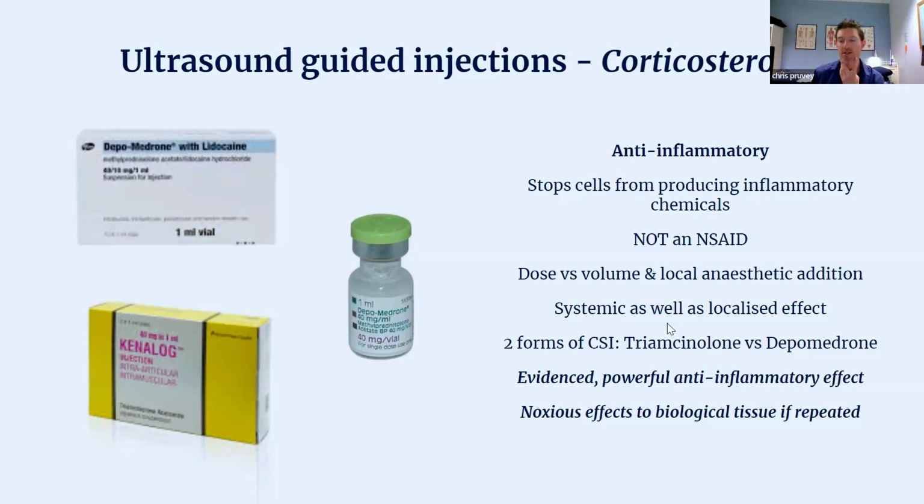Just to note, there's also a systemic as well as localized effect. So even if I do an ultrasound guided injection and it's within the capsule of a joint, the body will clear the steroid. Okay, so there is a systemic effect. And so we've done lots and lots of non-ultrasound guided procedures in the past, and they seem to have worked pretty well. That may be one mechanism in terms of why they've worked well. It's more the systemic effect rather than how good we are at getting the placement of the needle in all cases.